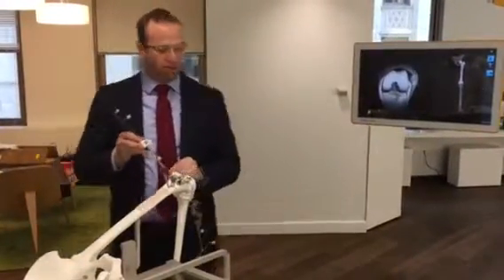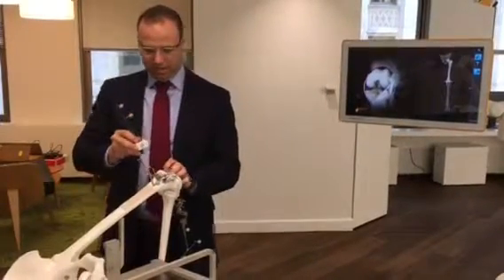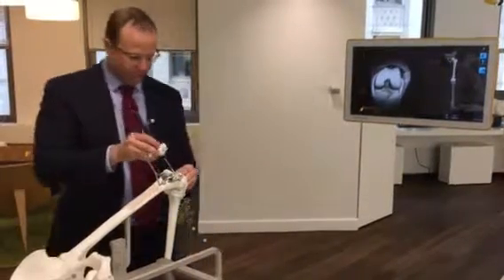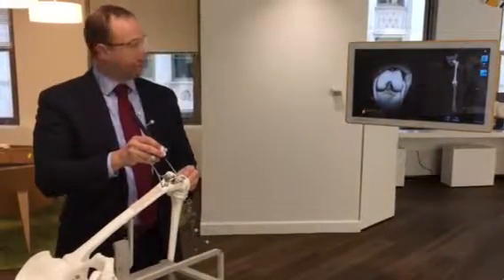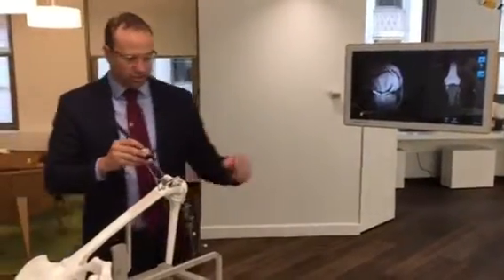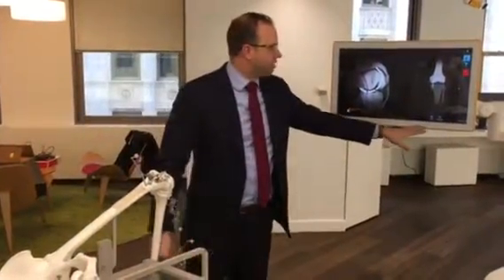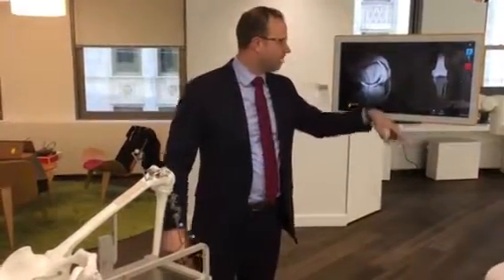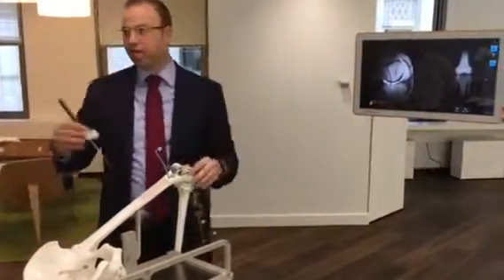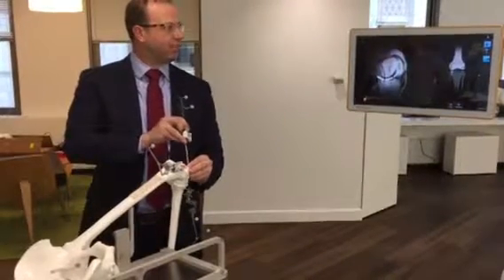With our new clicker here, we can come down and take several points pretty quickly. As you can tell, I'm not looking at the screen because the fact checking in the software will allow it to determine if I was medial or lateral on these points and correct them. We've also built in a skip and skip always function here, which allows you to say, if I choose not to take this point, I can not take it today, or it can become part of my profile to not take this registration. But here I do want to take the condyle because that information is important to me.